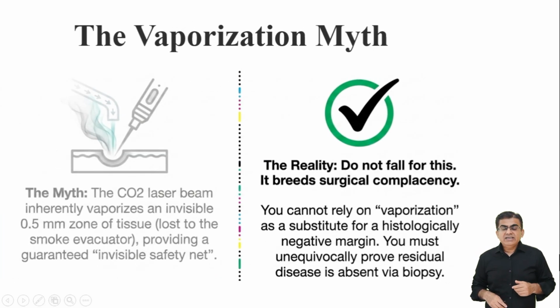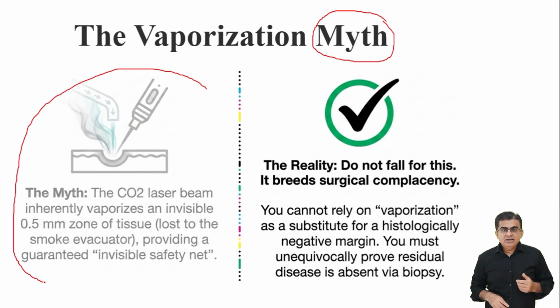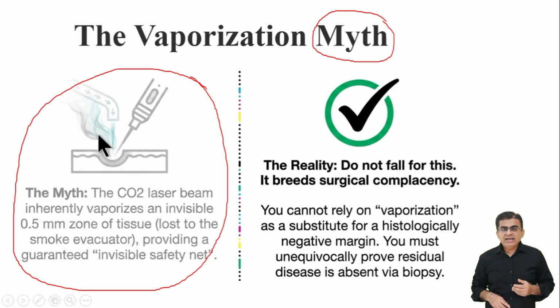Let us now talk about a very dangerous myth in laser surgery. It is called the vaporization myth. For many years, some surgeons taught a wrong concept. They said that the carbon dioxide laser automatically burns away an invisible half millimeter of tissue. They claimed that this tissue just turns into smoke and acts as a hidden safety net.